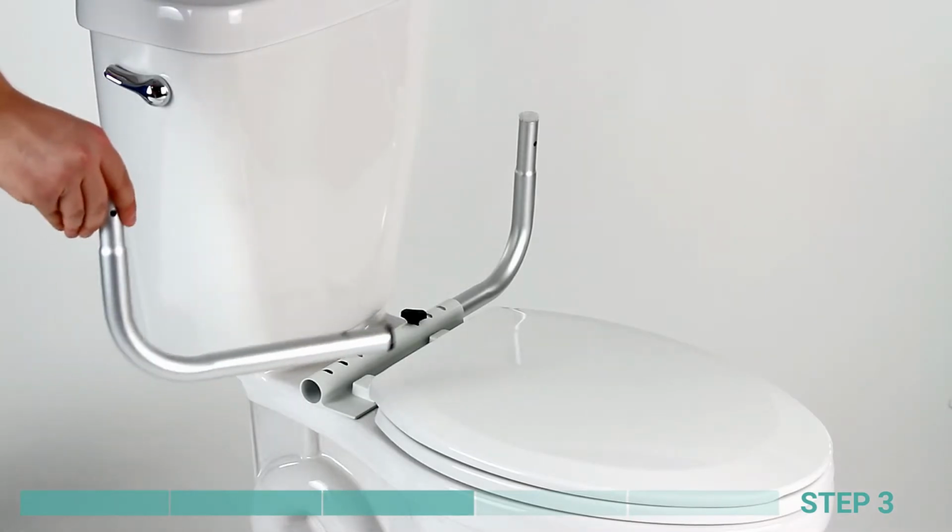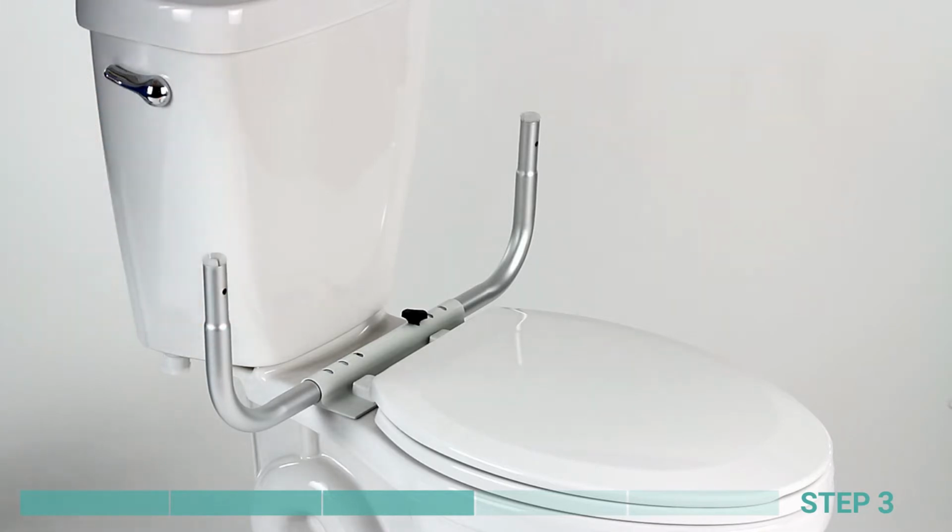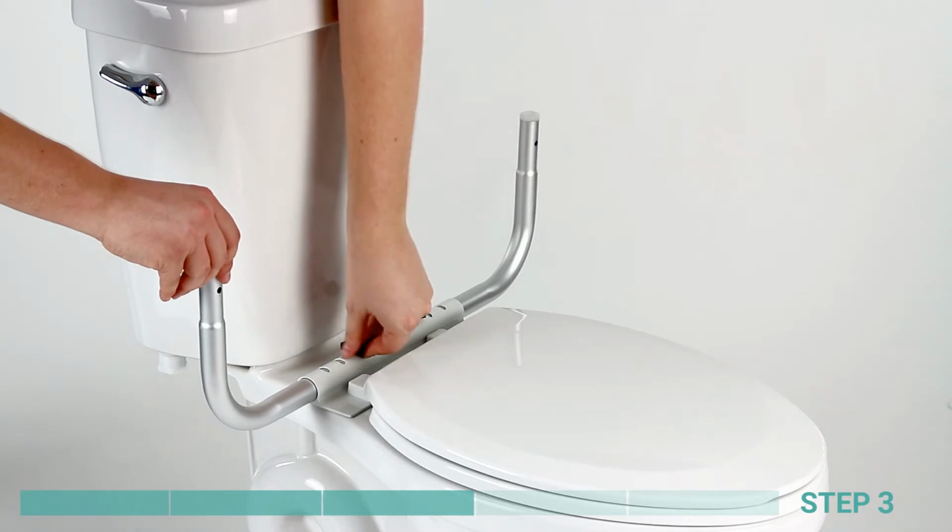Step 3. Insert wide ends of bracket arms into the loops in the toilet bracket. Align screw holes in bracket with screw holes in bracket arms and secure with bracket screws.